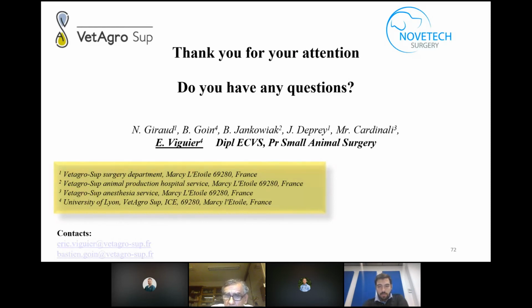I am sure that it's not necessary to use a bandage, but with the goat, who is always climbing, and she will be with the other goats. At this time, I remember I preferred to put a bandage, but she was too excited, and she moved a lot.